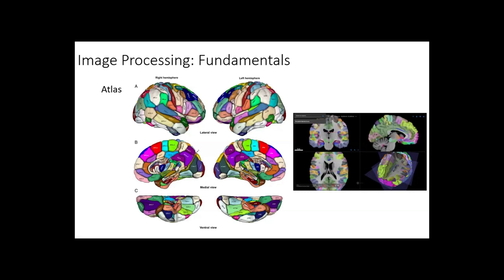So atlas is basically teamwork. We pick a subject, and we have a group of medical doctors who, based on their domain knowledge, use a brush or the mouse to give color to manually segment each region. It's maybe a year of team effort, but we only have one. We cannot do this for everyone.